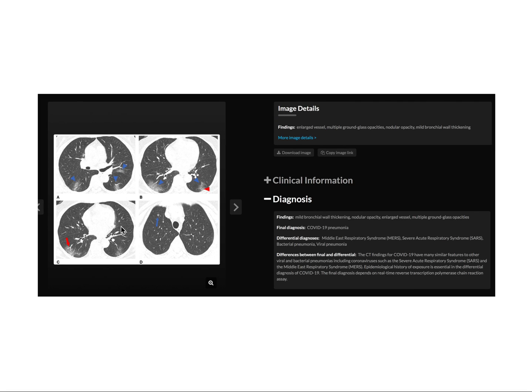Another case showing bilateral ground-glass opacity with peripheral distribution, basal segmental involvement. You can see the prominent vessels as well as bronchial thickening, and you can see some small ill-defined ground-glass opacity or nodule — all of these are again characteristic features of coronavirus.